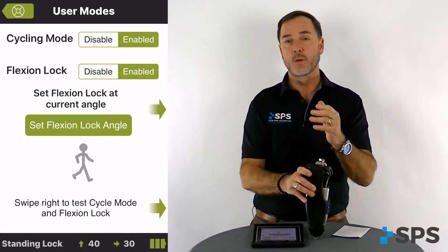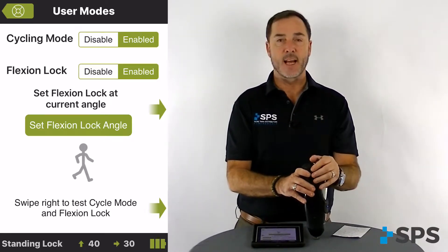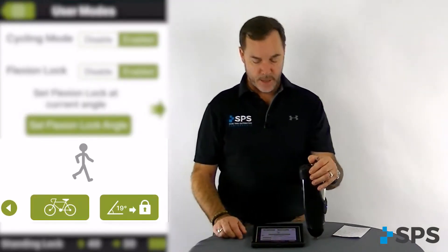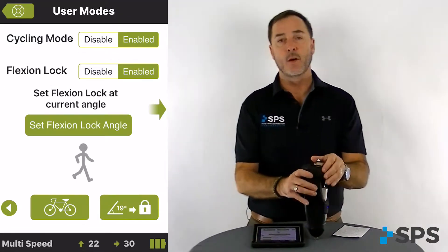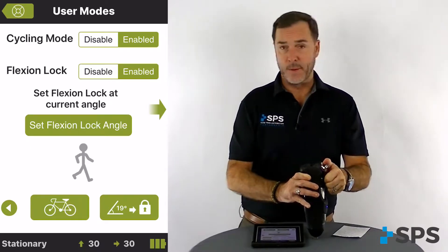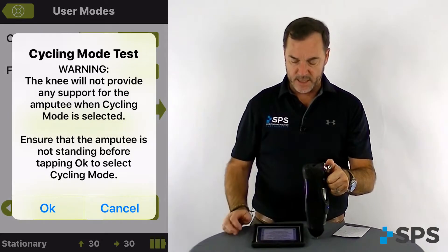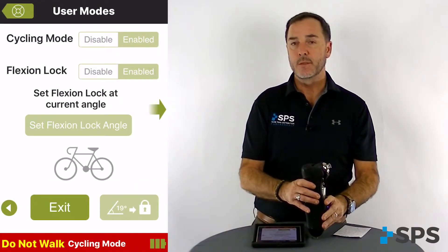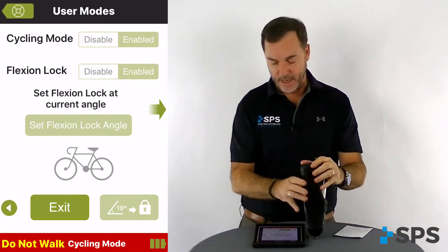From this screen we can also test the flexion angle lock and cycling mode. At the bottom of the screen, swipe right and you can see cycling and flexion lock appear. If you want to test cycling mode, the knee needs to be bent to a seated position — no load on the limb. Select cycling and hit ok. Wait for the beeps and now you'll see that the knee is actually in a free swing mode, so you can test that cycling mode.